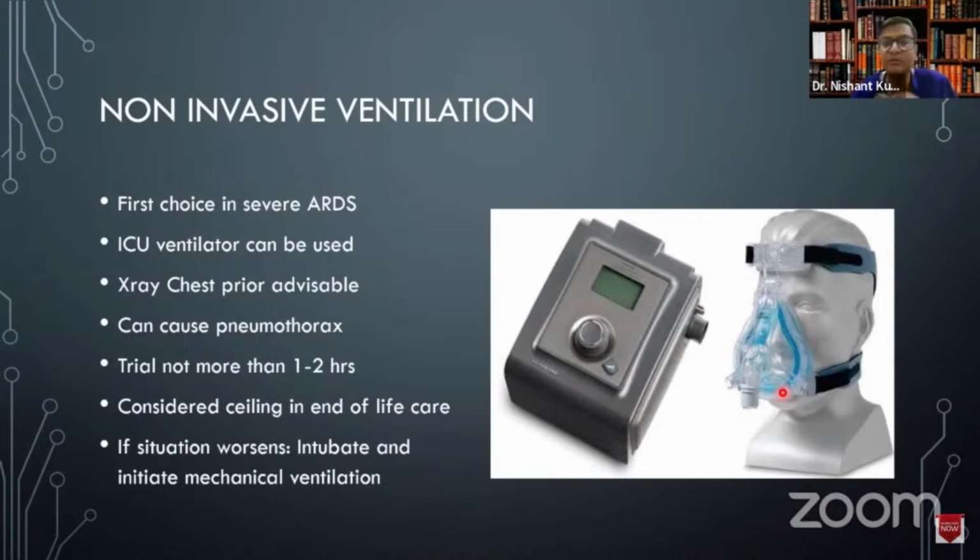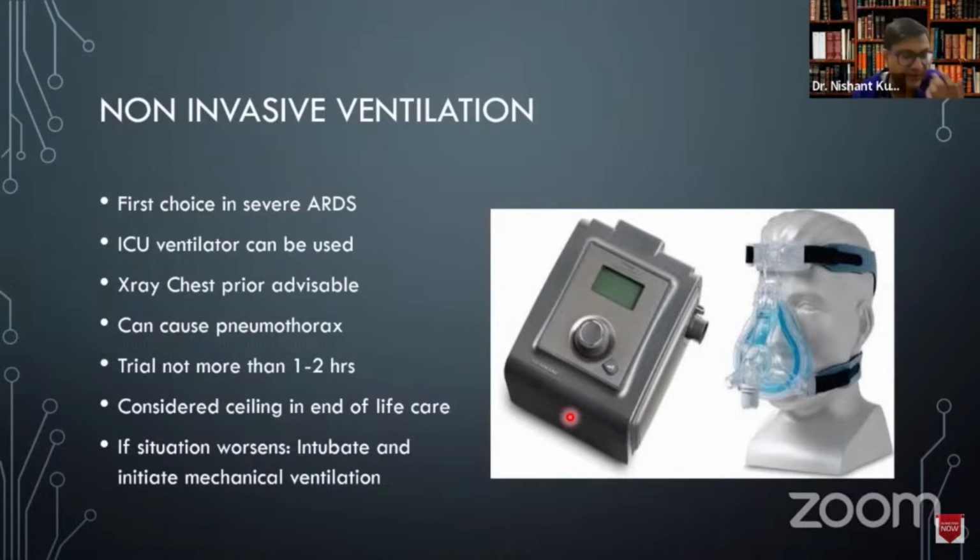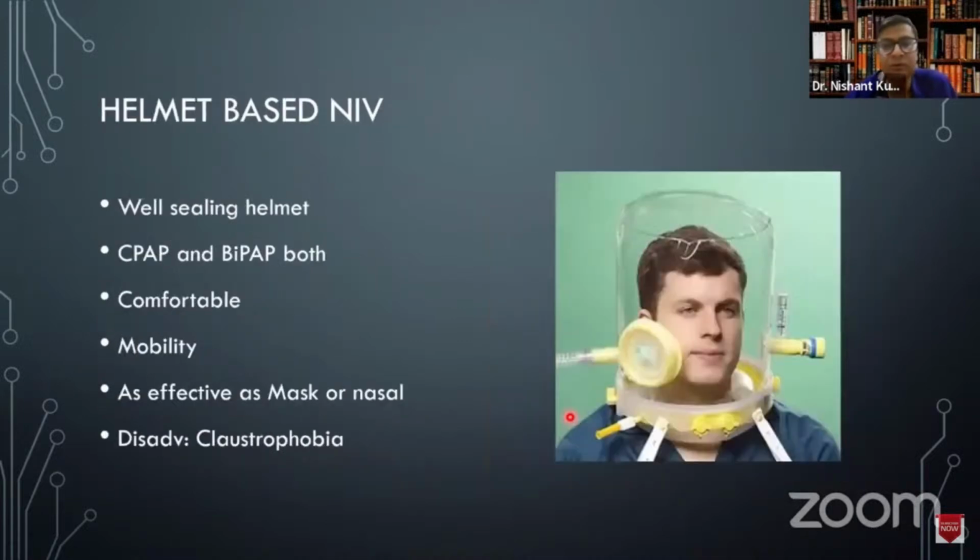And this was one of the major causes of pneumothorax that we saw in COVID, because the mask without the expiration valve was connected to these machines, and eventually the patient developed pneumothorax because of high pressure. Now, these masks are very tight. As I said, the patient cannot talk, and it's very uncomfortable with the tightness around the head and on the nose.